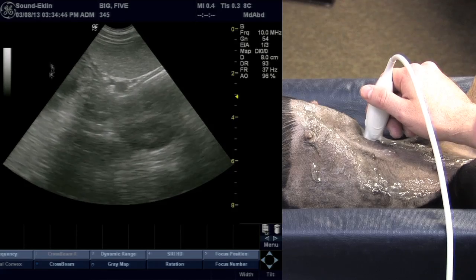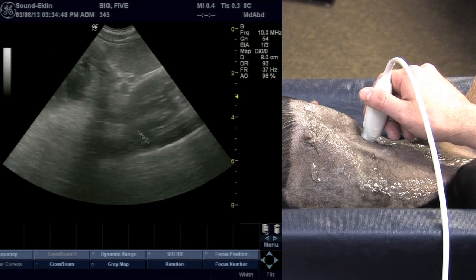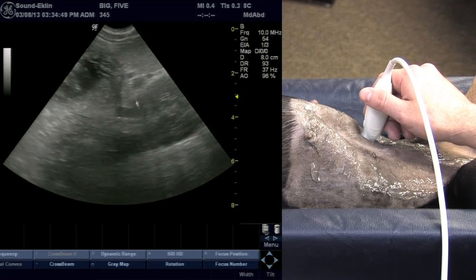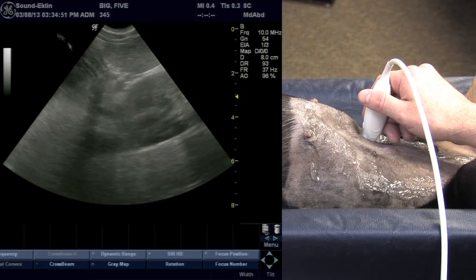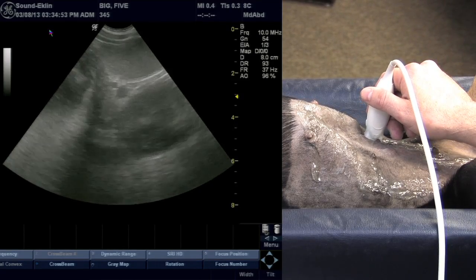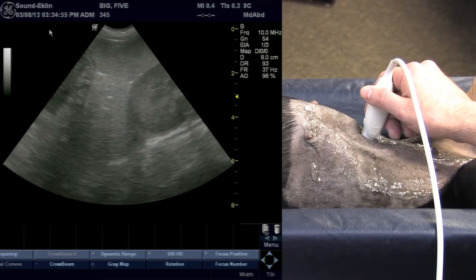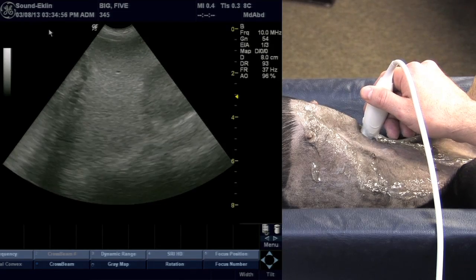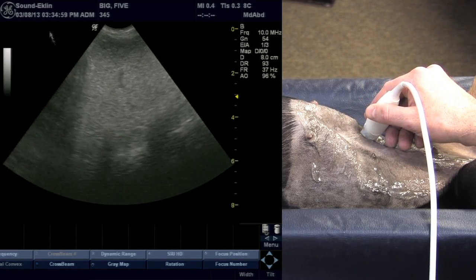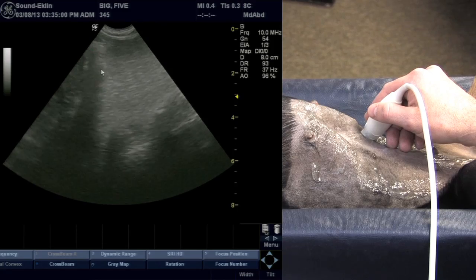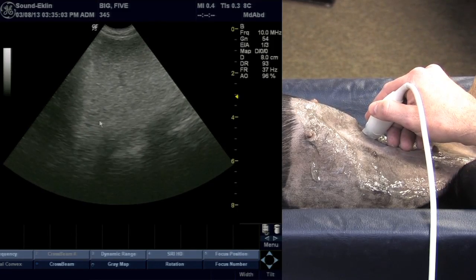From here we're at the body of the spleen and if we look, we've got stomach coming here, kidney coming here, and the splenic vein in the center. From this point I'm going to slide the probe towards the left body wall and gradually fan underneath the last rib, which will bring us to the head of the spleen.